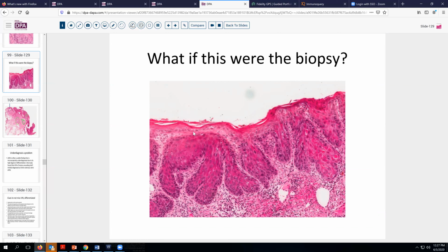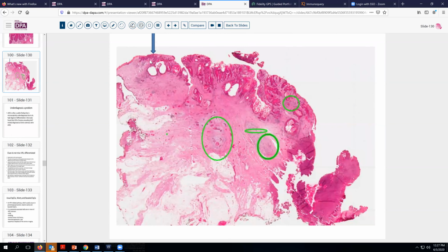And if you just said, well, this is squamous mild VIN or low-grade VIN, they might not take this quite as seriously. So that biopsy came from right over here. But as we can see, this is the area where we've got invasion. This is the granulation tissue type invasion. And here we had some irregular invasion as well.